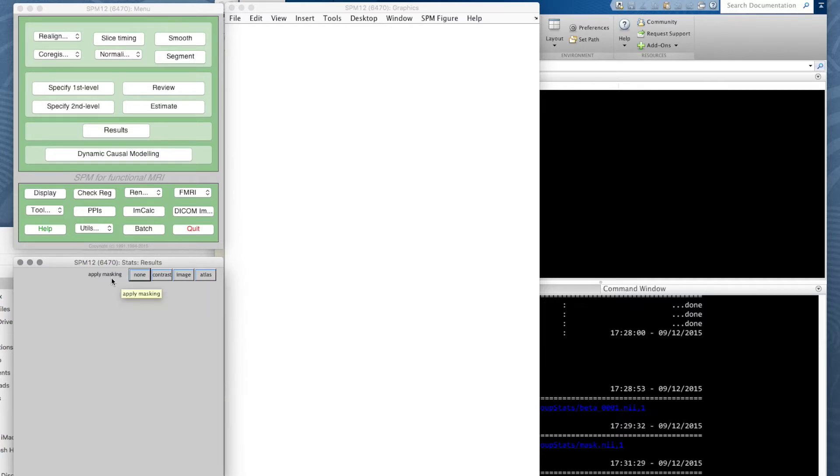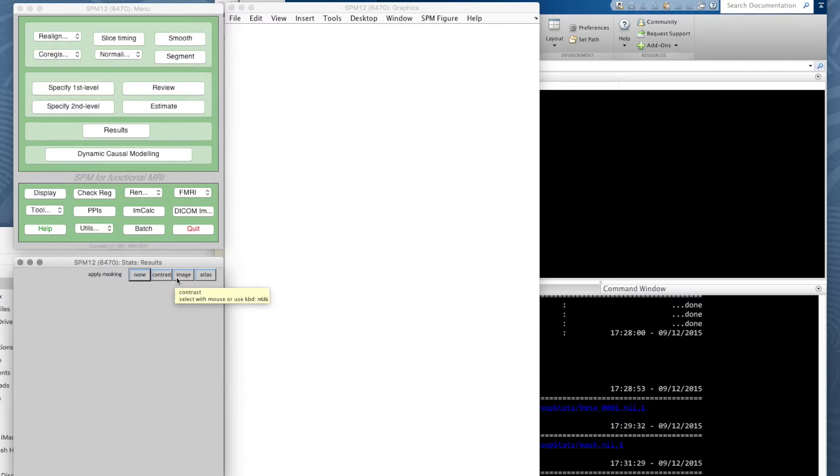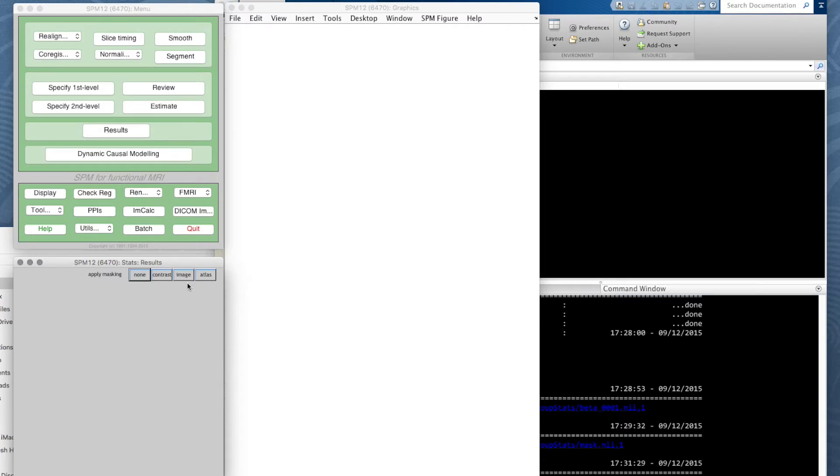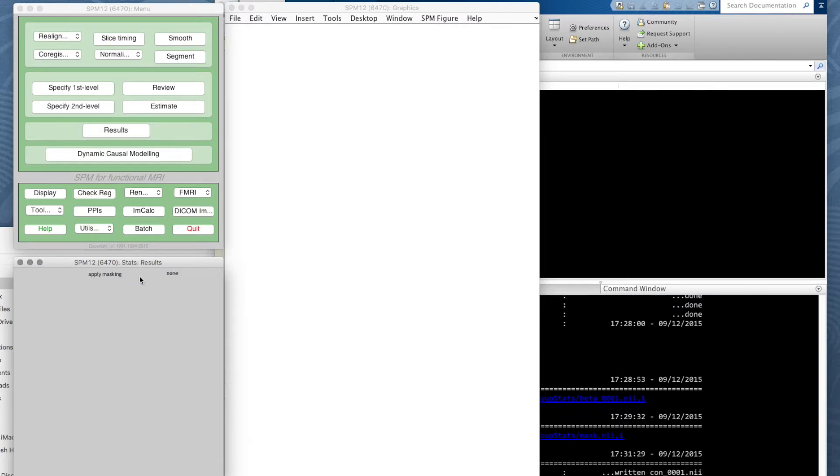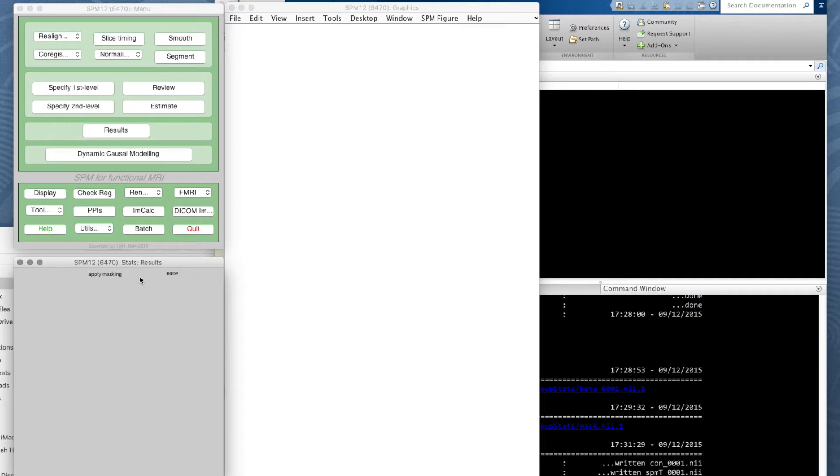Masking means masking off areas we're not interested in. You can mask off areas with another contrast you've defined, with a specific image, or using an atlas of brain areas. We're not going to do any masking—we're doing default whole brain analysis, so click none there.